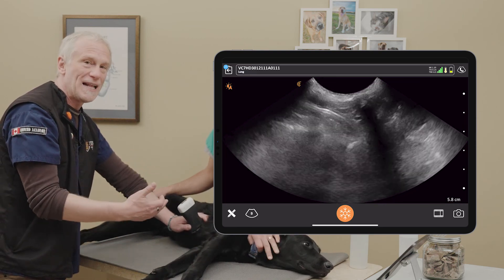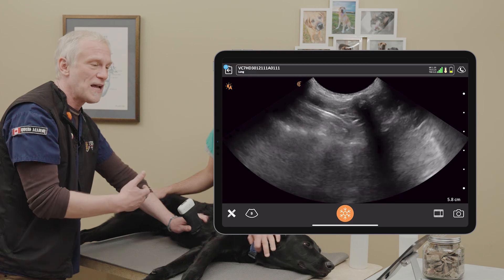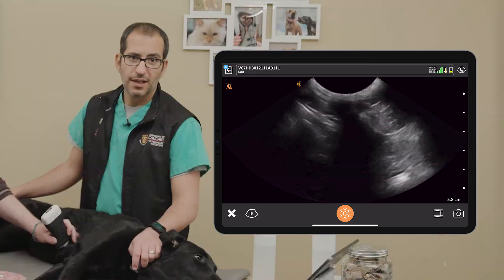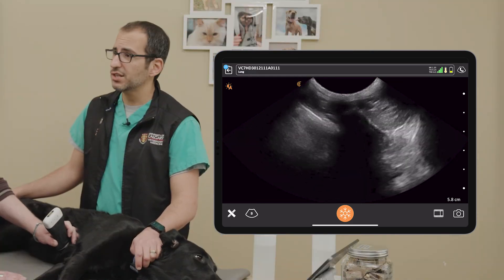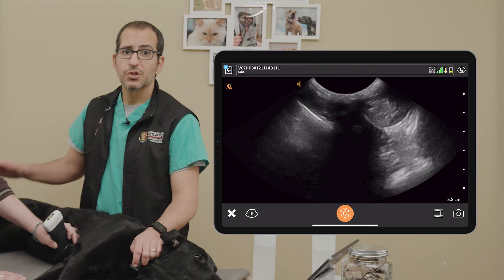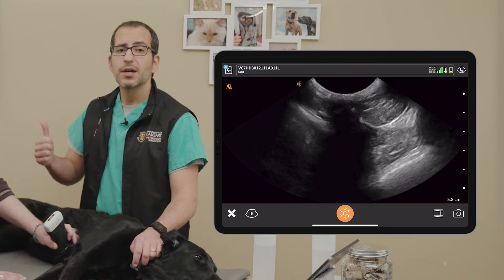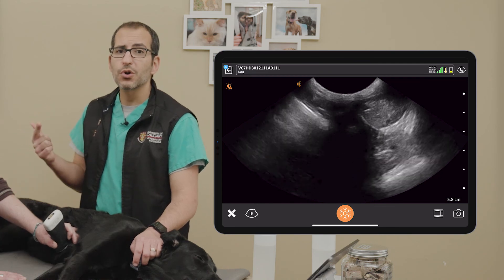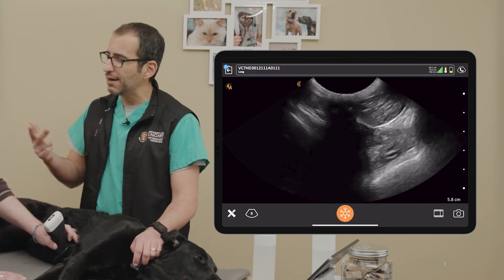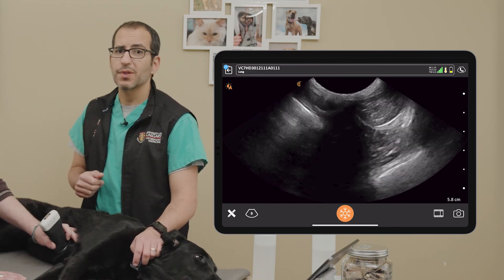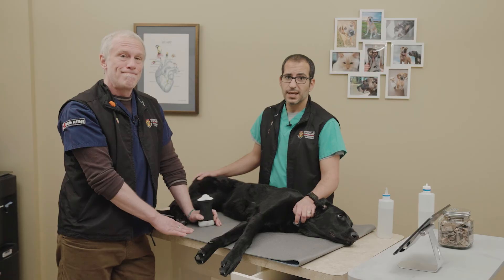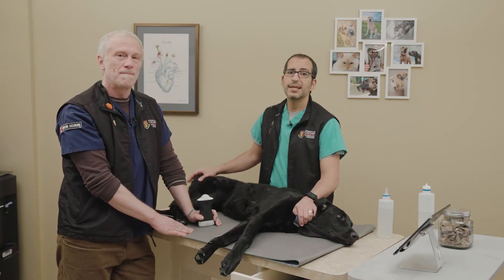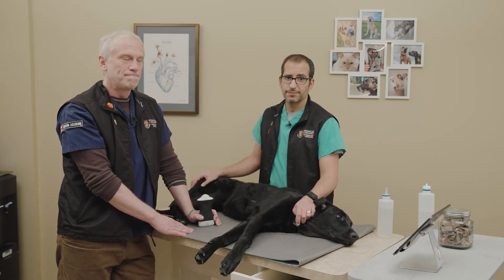That was a nice introduction to PLUS scanning. Remember: start over lung, know your borders, and scan from border to border. That's really going to help you identify, rule in, and rule out pathologies. Now we're going to take each pathology separately.